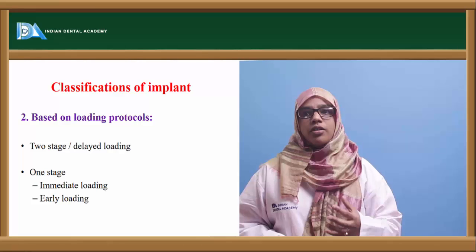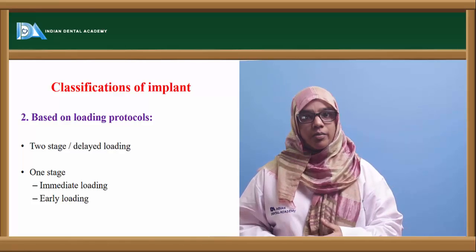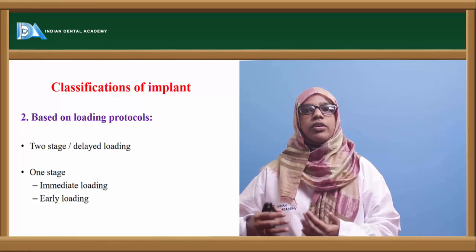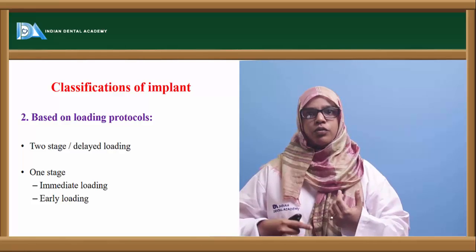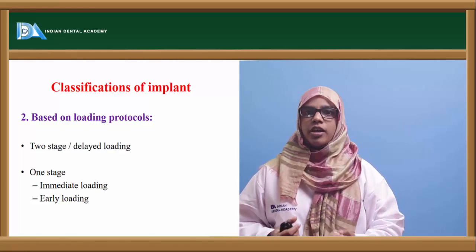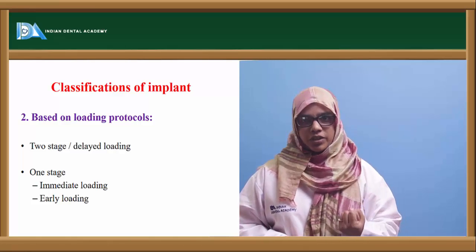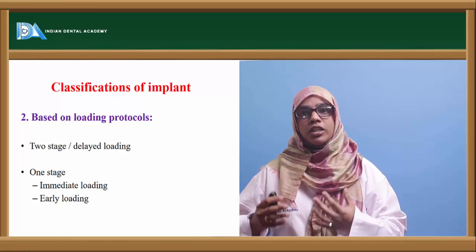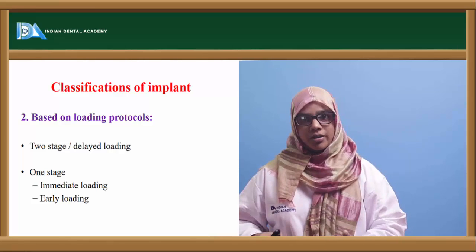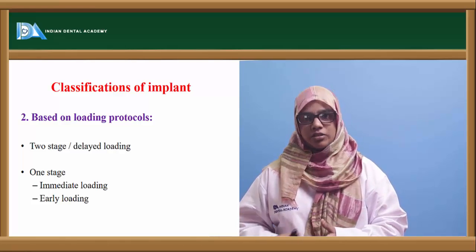Now, rather than directly subjecting the implant to stresses which will result in implant failure, why not increase the stresses gradually? If you go to a gym, you start lifting weight, you will start with 5 kg, 10 kg, 15 kg. You will not suddenly pick up 50 kg weight. That is, you're toning your muscle, you're increasing your muscle bulk. Similarly, you cannot suddenly increase the stress on the implant. You have to progressively increase the stress on it.